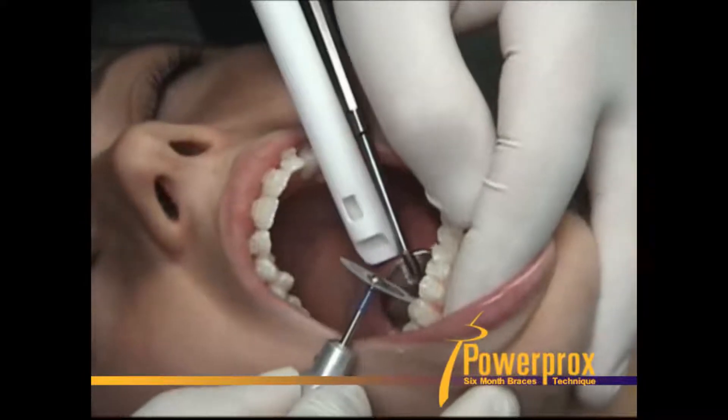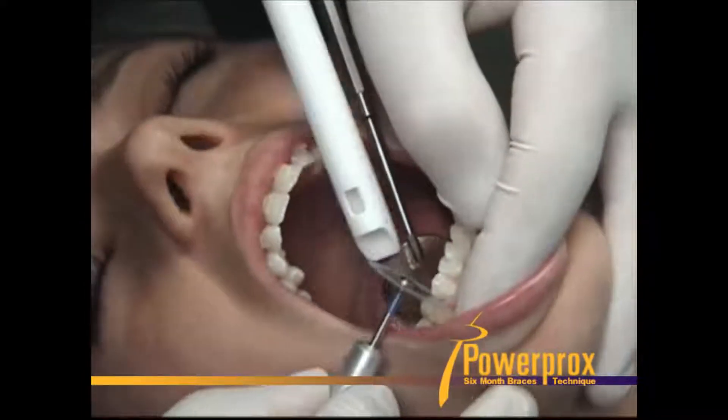Okay, and you want to floor it too when you're putting this disc in. Just floor it, go down, boom — there's one right there.